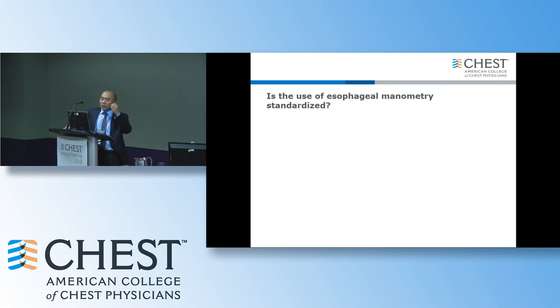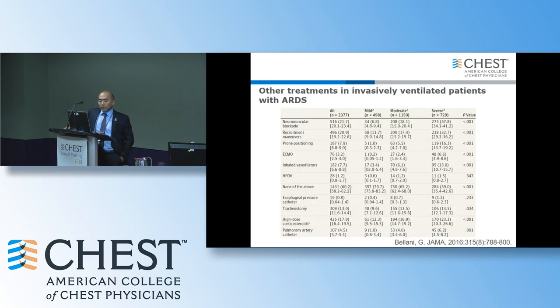Now, is the use of esophageal manometry standardized? This is the report of the SAFE registry, where we can see that just 1% of the population with ARDS in 50 countries are treated with an esophageal manometry. Okay, and mostly those with severe ARDS. But on average, it is less than 1% of patients with ARDS.